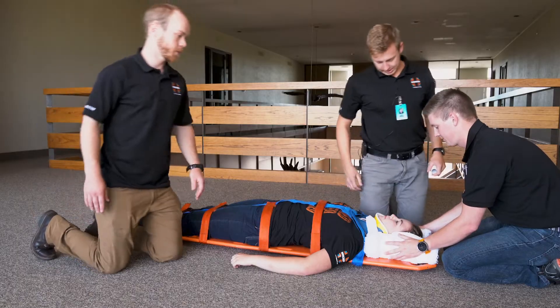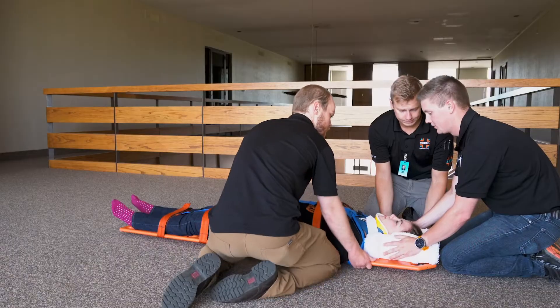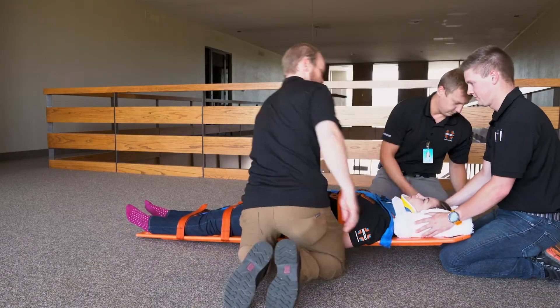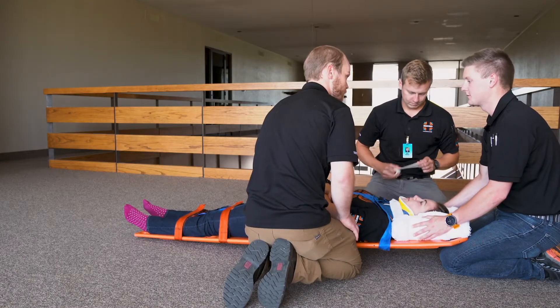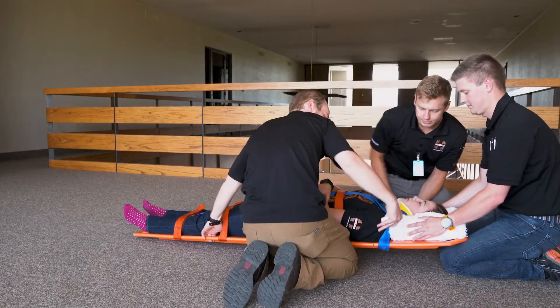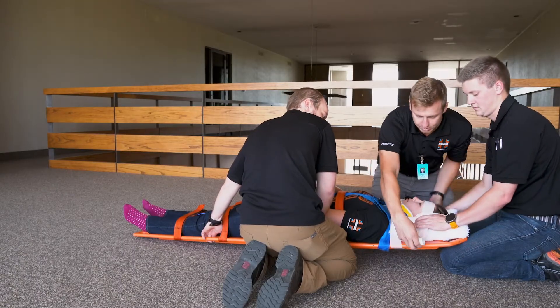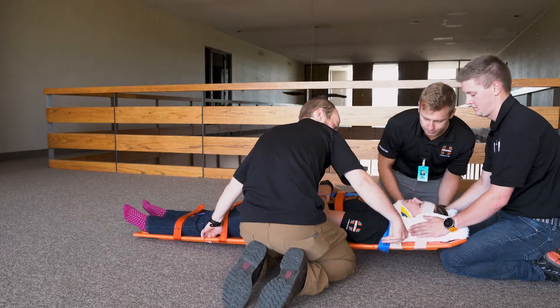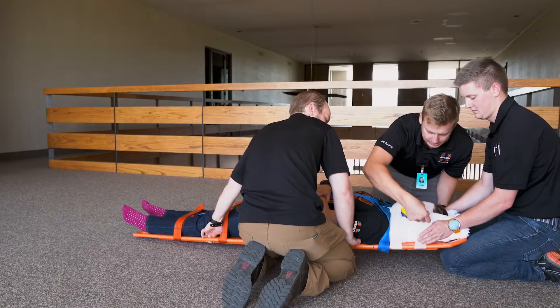Can we lift this up to your knees? Absolutely. Okay. Your count. One, two, three. One, two, three. One, two, three.